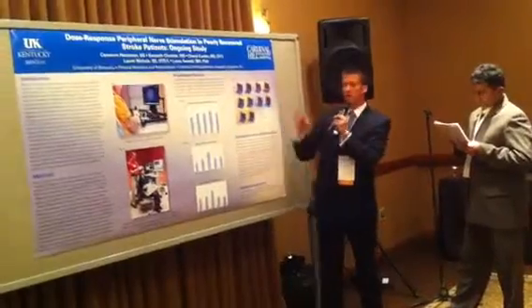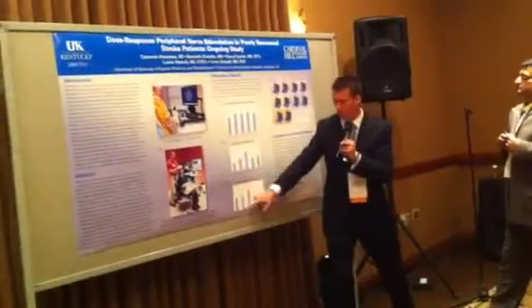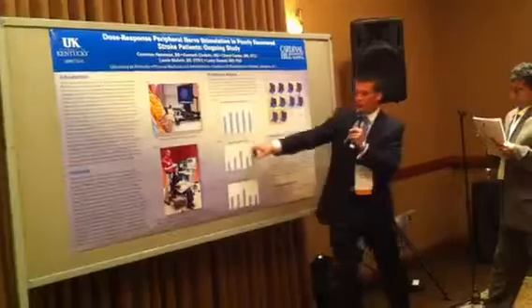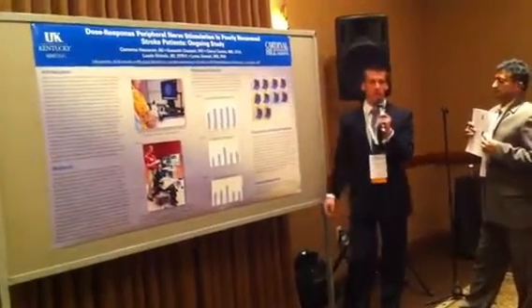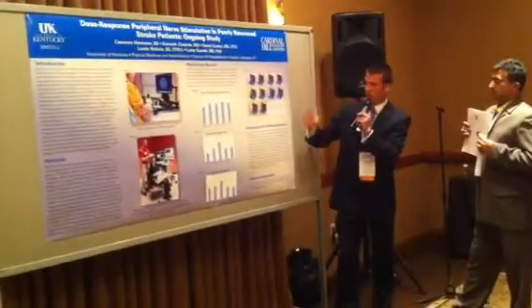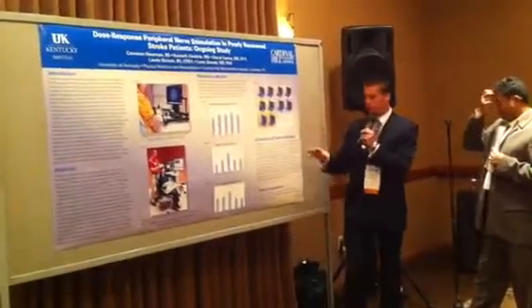So we see the greatest changes occurring in the above before group, which is right here, and the below during group right here. It's also important to note that in the above before group right here, we see the establishment of a new spot ipsilesionally that was not present at baseline. So that speaks for itself, that this person had a stroke years ago and all of a sudden a new spot could arrive that wasn't present at baseline through this intervention.